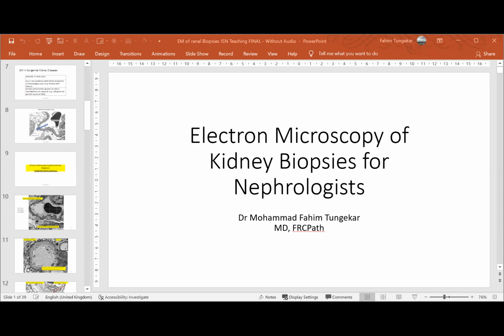Let me begin with the entire process of diagnosis of kidney biopsy, that will help us define the position of electron microscopy in the process. So the biopsy is taken here, and that's the end point here, a morphological diagnosis. A morphological diagnosis should describe adequately the state of the renal tissue. It should try to identify the underlying pathological process and render a proper diagnosis that helps the clinician make decisions about treatment of the patient and may give a hint about the renal prognosis, and so on. So that is the diagnosis, the aim we are trying to reach.